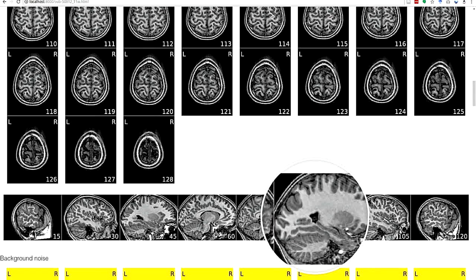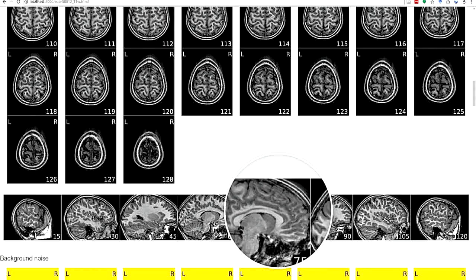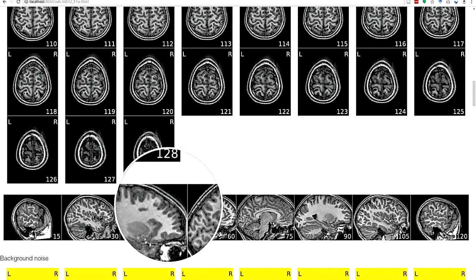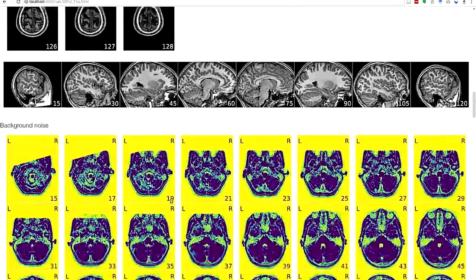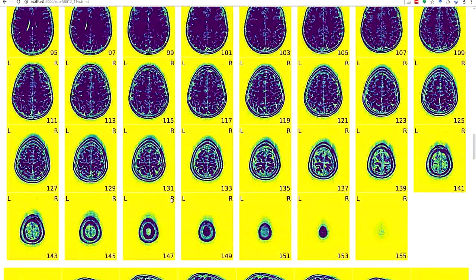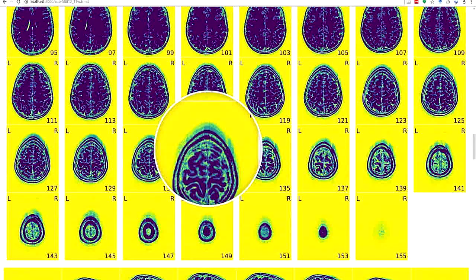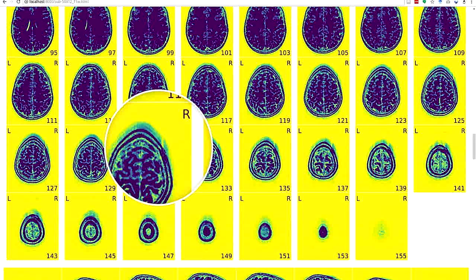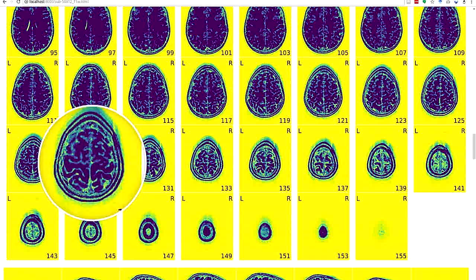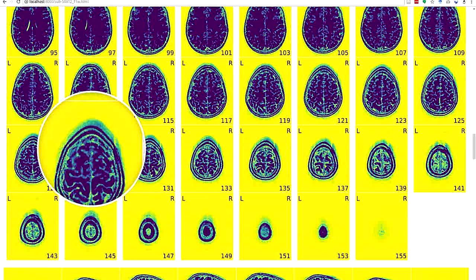And this example was acquired on a Philips machine with Sense activated. And this kind of acceleration also has a noise reduction. So you will see a different pattern of noise in the background. Basically, it's almost removed. But if the subject moves, you can see how it tricked the Sense technology. So you can see those ghosts in the background.